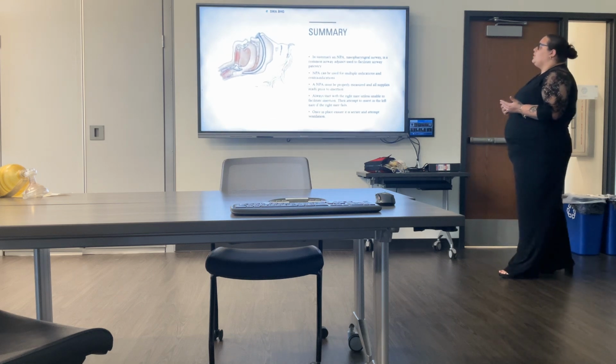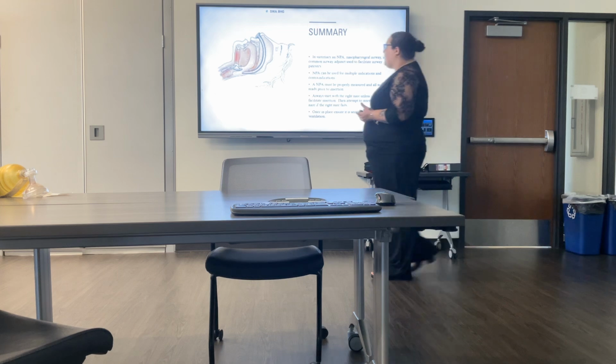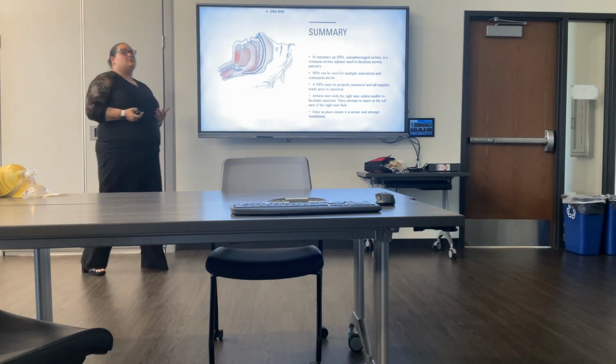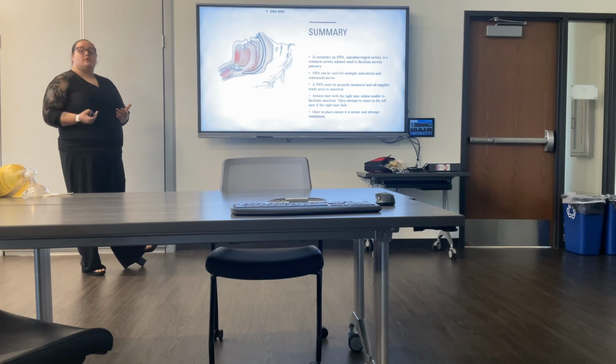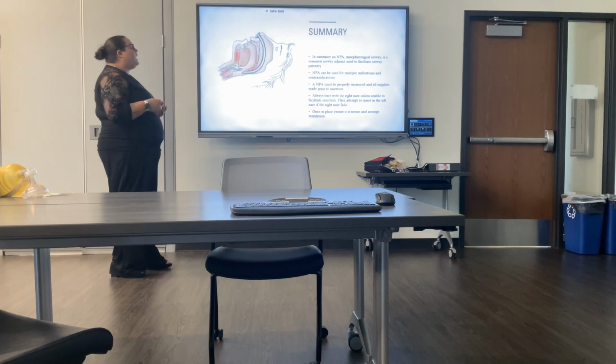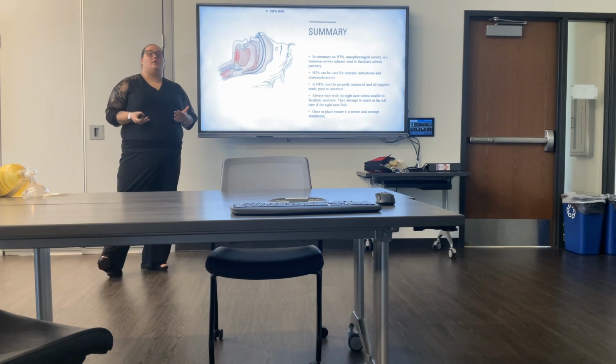So in summary, your nasopharyngeal airway is your common airway adjunct we use to facilitate airway patency. It can be used for multiple reasons, and there are many reasons we should not use it, so you need to be familiar with those reasons prior to inserting one in a patient. It must be properly measured, and all supplies need to be ready prior to you inserting it.